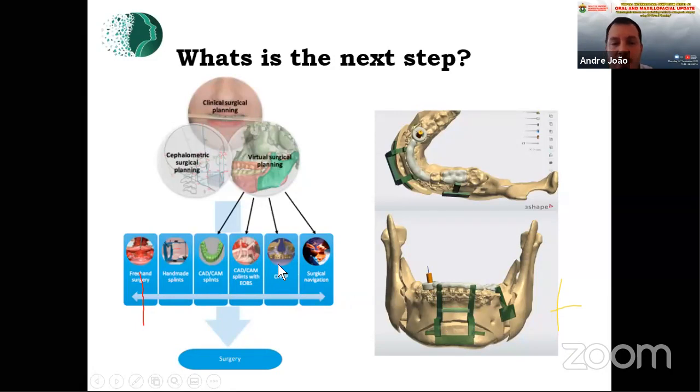There are the three patient-specific plates. It's another thing that helps surgeons in surgical navigation. I can say technology is good, but sometimes it's too expensive. Like these patient-specific plates.